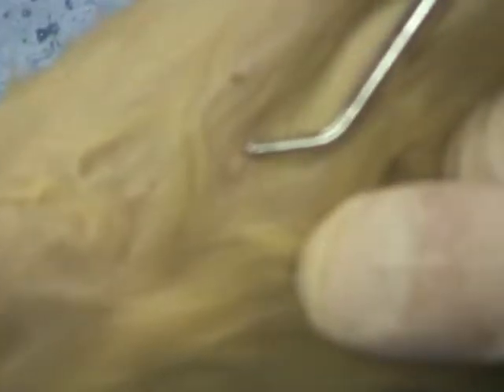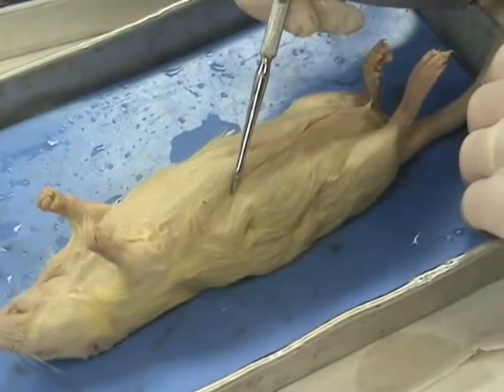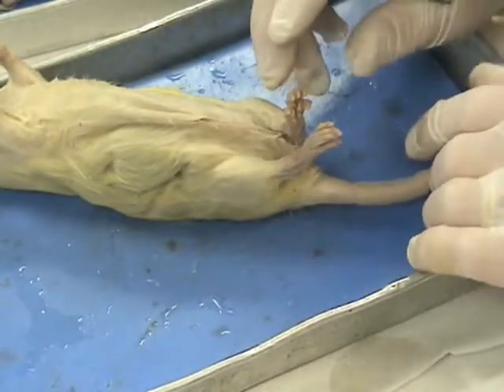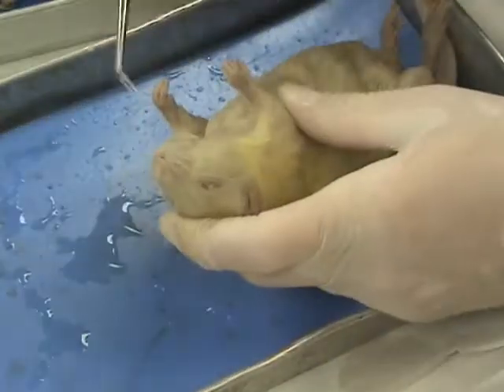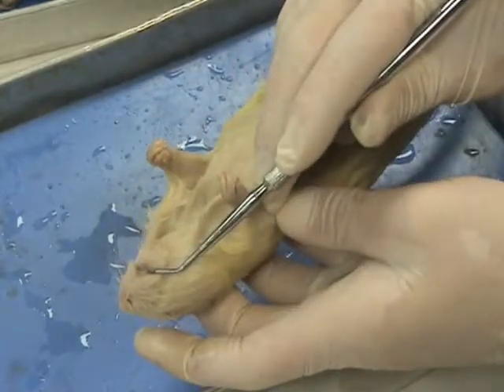They're easier to see on a pregnant female than they are on a non-pregnant female, but both male and females have nipples there. Some other items that are identified on that sheet, we have legs and feet and tails, and I don't know if that's terribly hard to figure out, but some other terms, scientific terms for the nostrils. We've got the external nares. We also have the teeth, and you read in there about how the teeth are worn down.